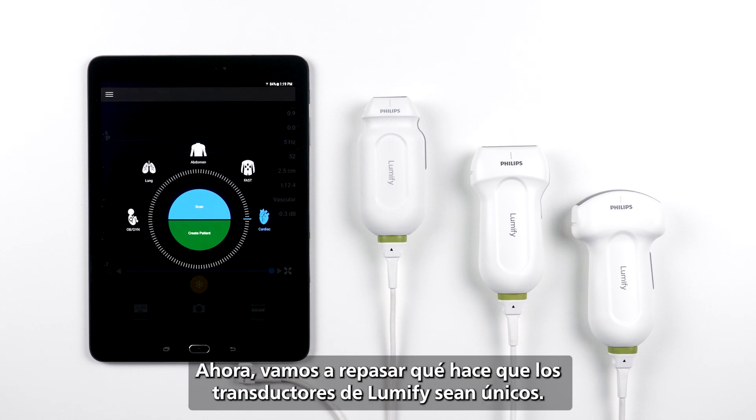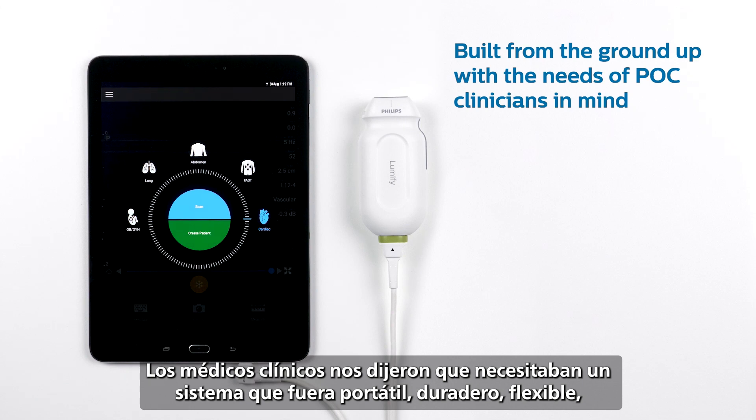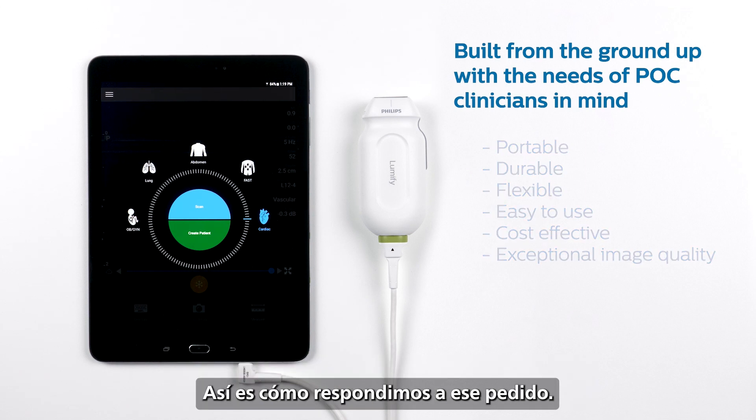Now let's go over what makes Lumify transducers unique. To start, Lumify was built from the ground up with the needs of point-of-care clinicians in mind. Clinicians told us they needed a system that was portable, durable, flexible, easy to use, cost-effective, and yet maintained exceptional image quality. Here's how we answered the call.